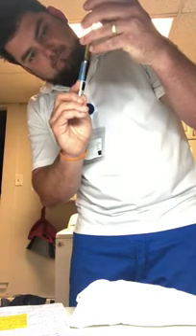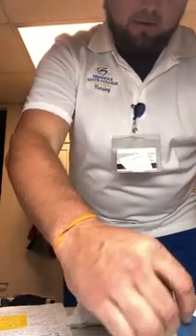0.5. There we go. Okay. Put that to the side, and I'm going to recap the needle. Okay. We have our 2 injections prepared. I'm going to sit the patient up, and we're going to be doing the intramuscular deltoid injection first.